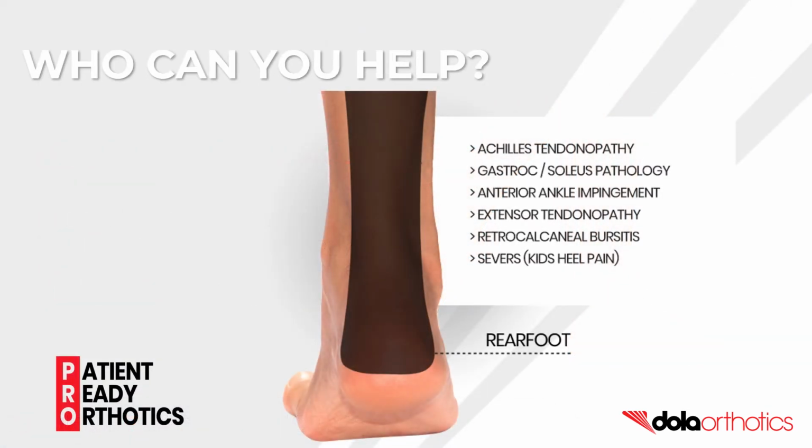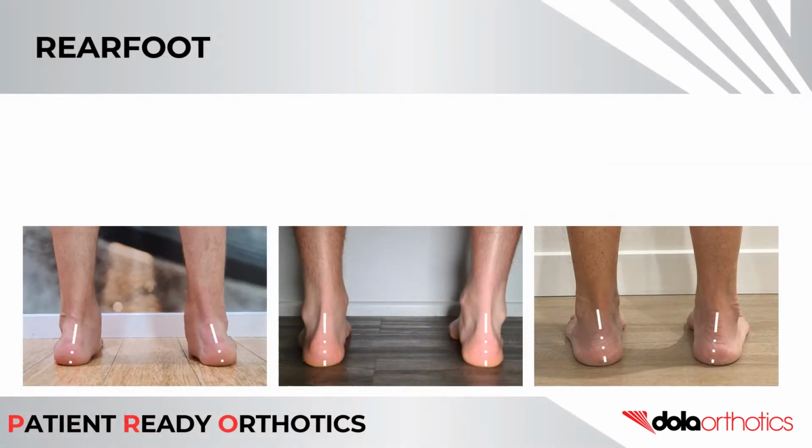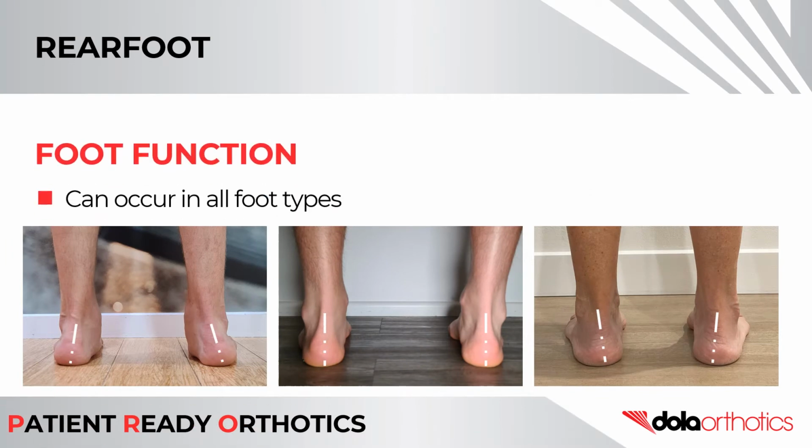Rear foot pathologies can be linked to different foot types, gait patterns, and pathomechanical function, including the supinated or pes cavus foot, the pronated or flat foot, and even the relatively normal or neutral foot. It is most commonly seen in patients with ankle equinus or a sagittal plane block of the ankle.